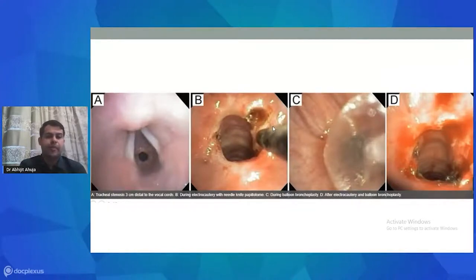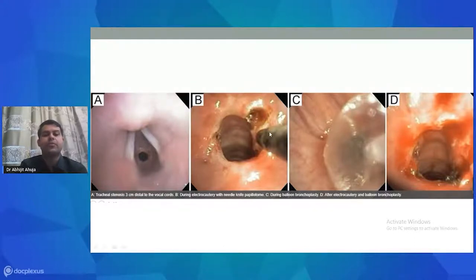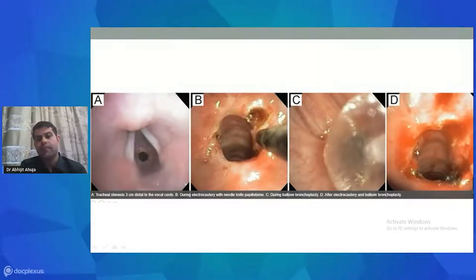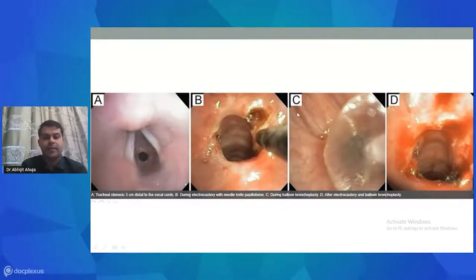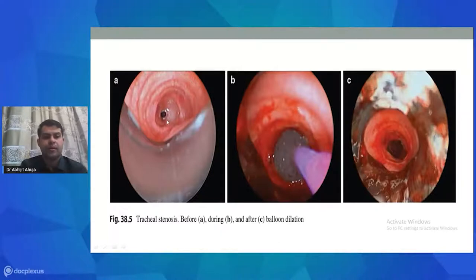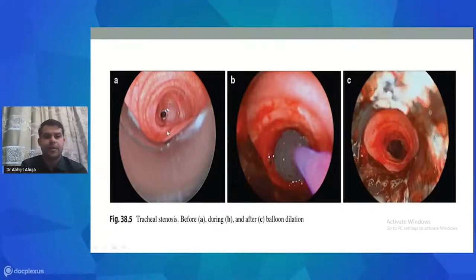This is an example of a tracheal stenosis 3 cm distal to the vocal cords. Incisions are being made through an electrocautery knife to allow balloon insertion into the stenotic segment, which was too small to accept the balloon directly. The end result shows almost more than 90% dilatation, effectively eliminating the lesion. Under the rigid bronchoscope, the lower end of the tracheal lesion is also shown, with balloon dilatation achieving adequate patency.